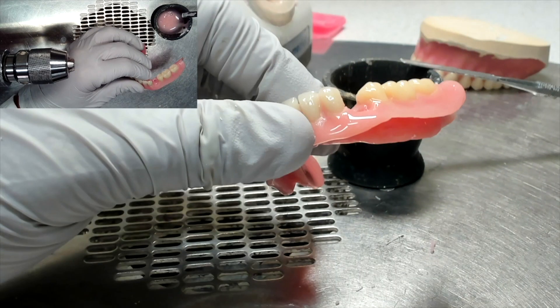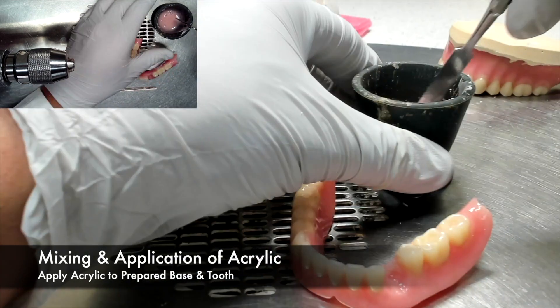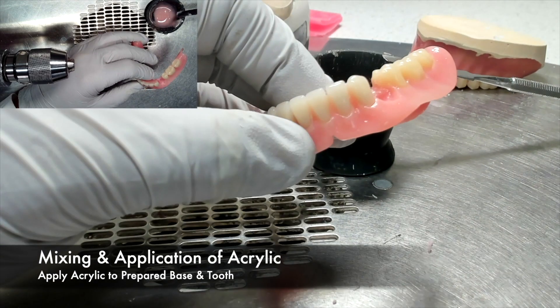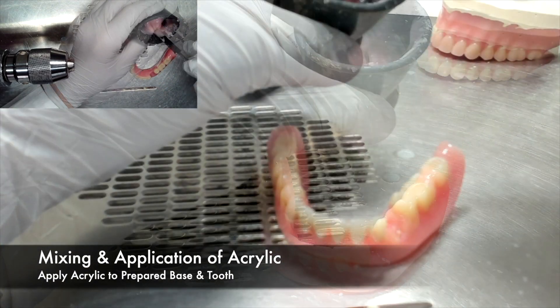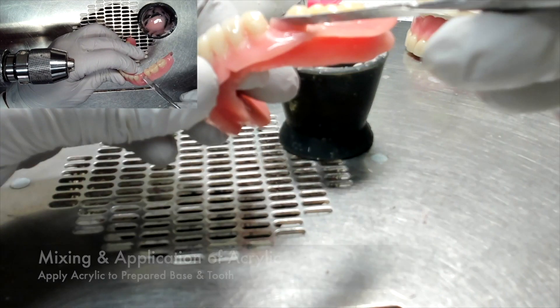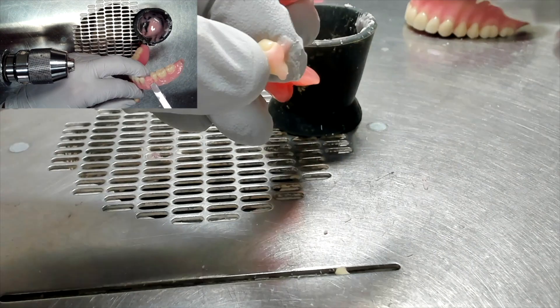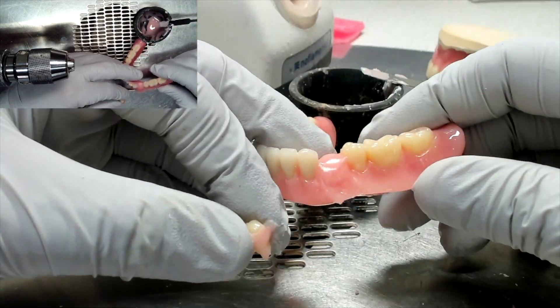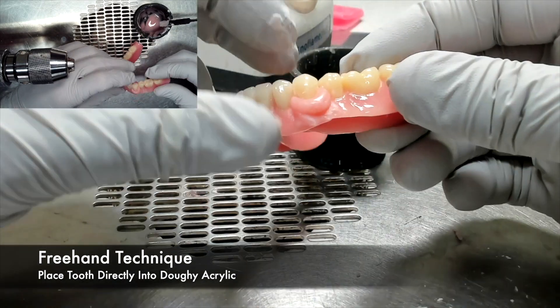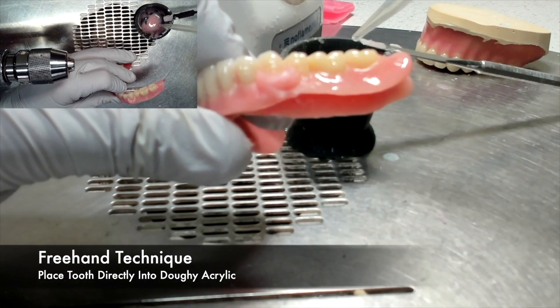Once the denture tooth has been fitted properly into the denture base and all surfaces have been prepared, it's time to mix the acrylic. Once you have mixed the acrylic and it's reached the proper consistency, you can then begin to add acrylic to the prepared denture base. When performing a freehand technique, you will wait until the acrylic has reached its doughy stage, and then press the denture tooth directly into the doughy acrylic.